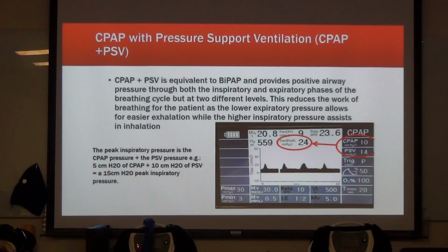You'll ask yourself, okay, so what type of patients are these? Well, you've seen them, you've transported them, but at some point you're going to be using this in the field on your 911 calls. And so you have to go, well, when will I use it? When do I use CPAP versus the CPAP pressure support? I think it's based on the acuity of your patient and how well they're doing. If you start them on CPAP and they're like, oh, this is great, I'm feeling better, and you're seeing better results, then I'm fine there.